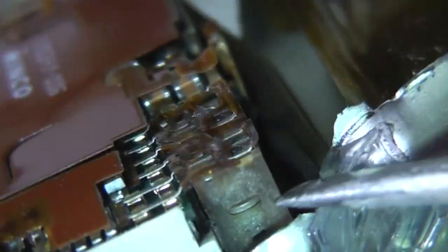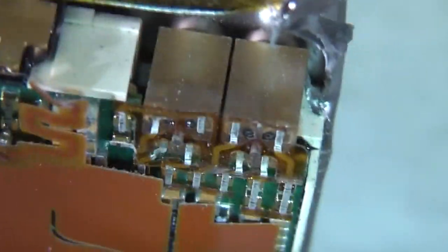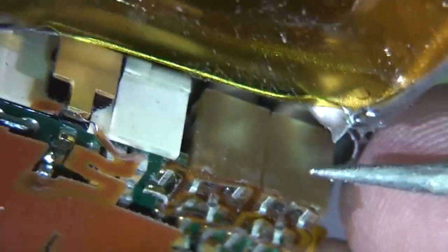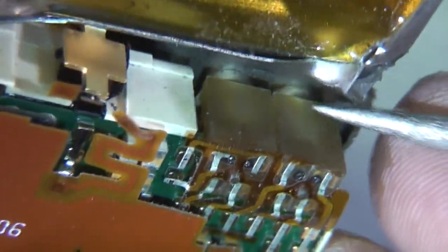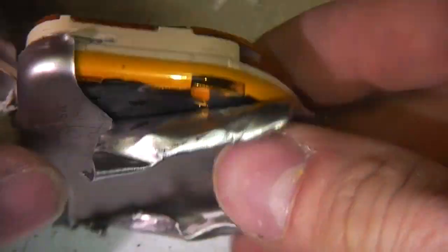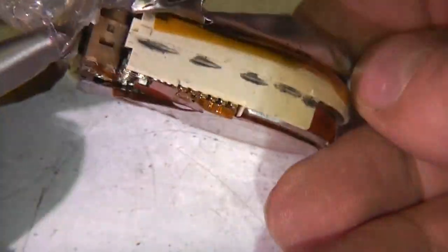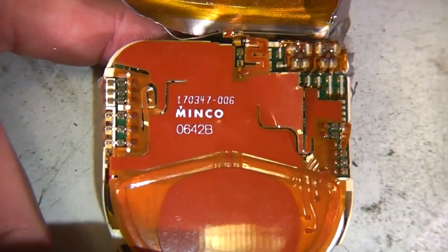Basically the other side of these are just going to be some sort of wire feed through seal. There's probably maybe some RF filtering in there as well, because obviously it's quite important that these things aren't susceptible to mobile phones and other magnetic fields and RF interference. So there's going to be a seal up there, but I think these could just be sort of filters. We'll have to pull those apart too. The other side of the can does seem to be fairly well glued to this plastic carrier, so I think we'll go in from the top and see what we can find from this side.